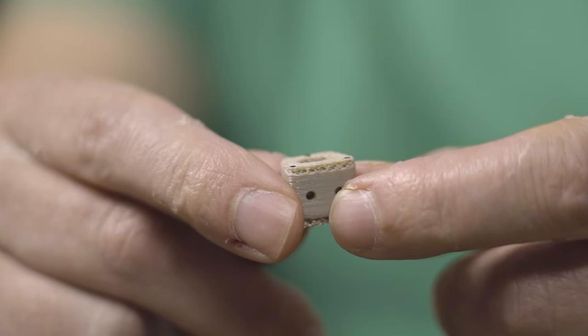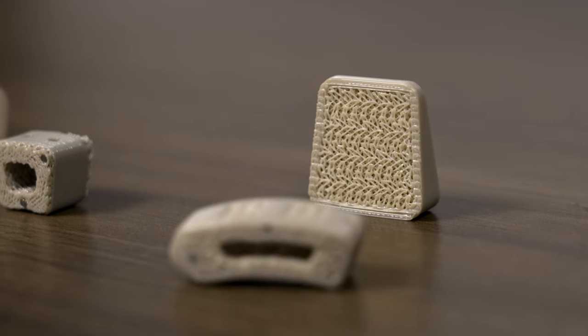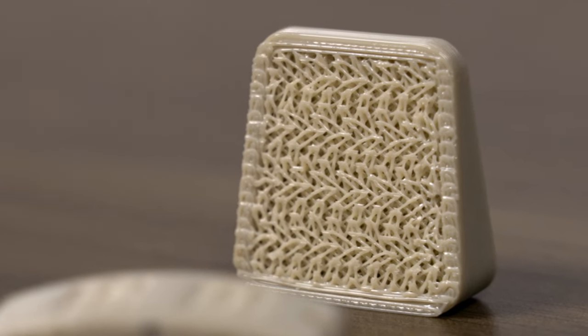You see a lot of clearance of implants that are compression molded that may have some interconnected porosity. That's not the same PEEK as one that's been built layer by layer in an additive manufacturing sense, because each layer can be put in compression and can be a toughening and strengthening mechanism. There's a good bit of literature out there showing that even the strength of PEEK can be taken to a much higher level depending on its crystallinity and its thermal history. Those things inherently affect our ultimate strength properties. And so we achieved a compressive strength 6 times what is required for physiologic loads and 2 to 4 times any implant that's on the market. It's indeed because of this 3D printing approach.